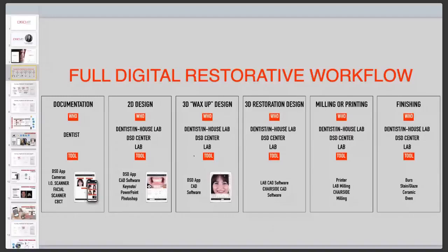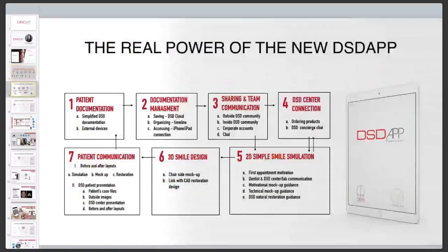So here is an overview of everything that we believe makes the app powerful and can help you in your practice in different stages of the patient treatment. I can't only talk about the 3D in this webinar because the app is much more than that. It's much more than a tool for 2D simulations and also much more than only 3D designs.